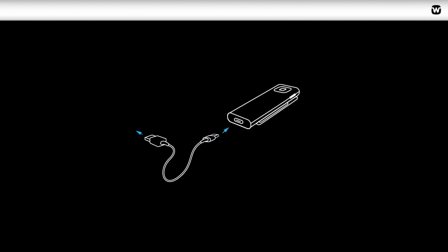Before you use the Remote Mic for the first time, make sure it is fully charged using the USB cable included.